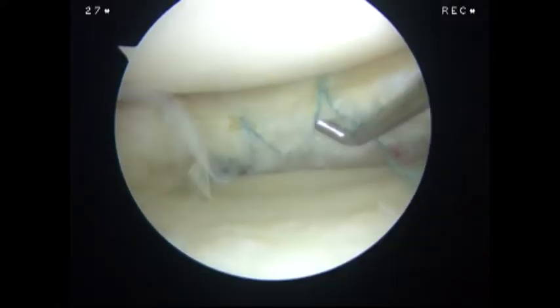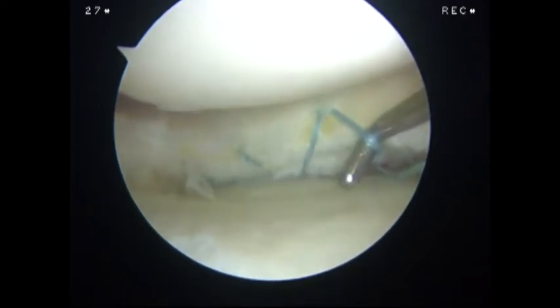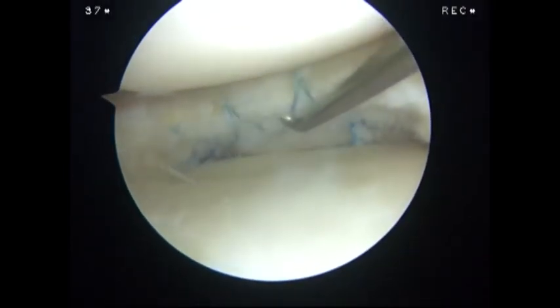In the final stage, all stitches are checked with a probe and tightened if needed. At the end of the procedure, both ends of the sutures are brought out through the anterior medial portal with a suture manipulator, and a classic non-sliding knot is created. The knot is placed under the inferior surface of the meniscus for prevention of abrasion and irritation of the cartilage. Finally, the stable construction is checked with a probe.